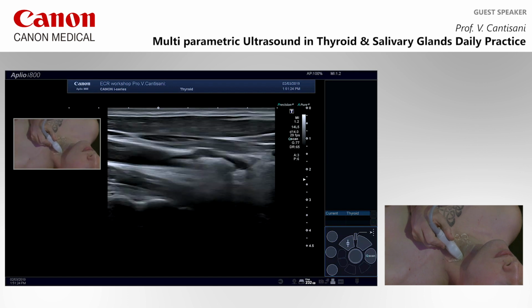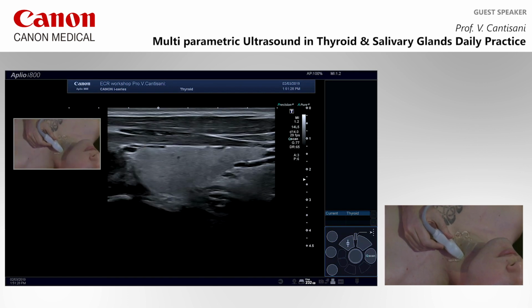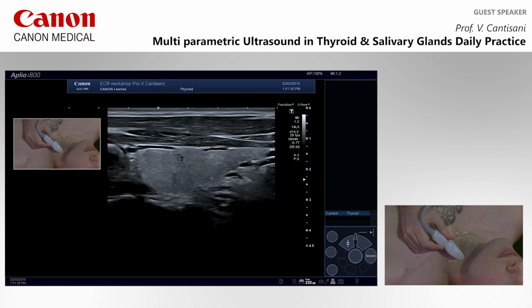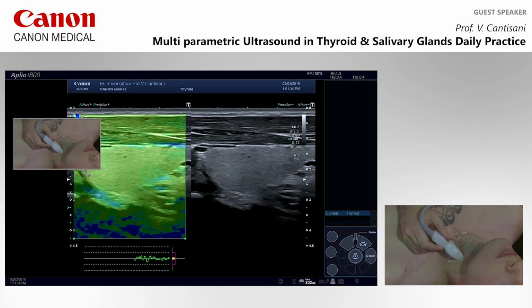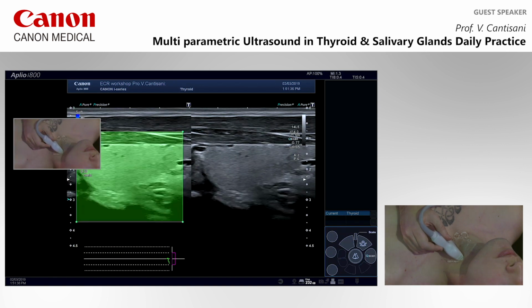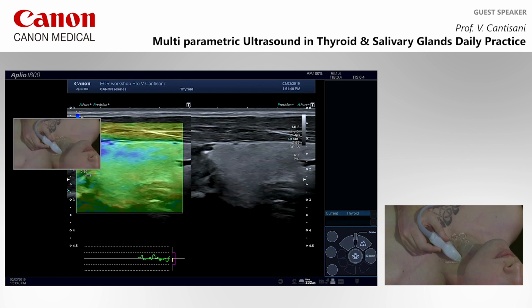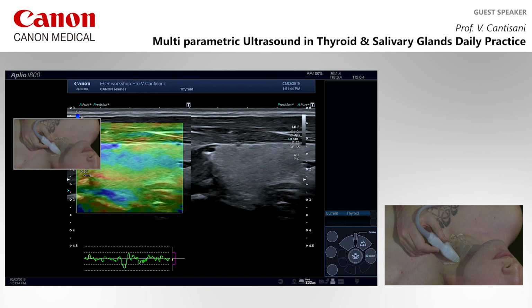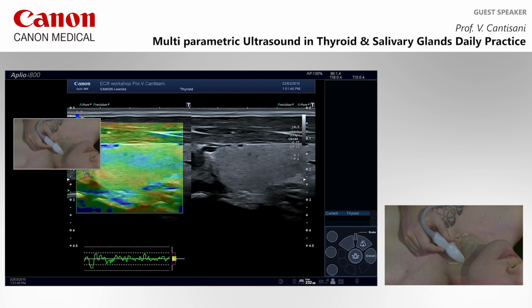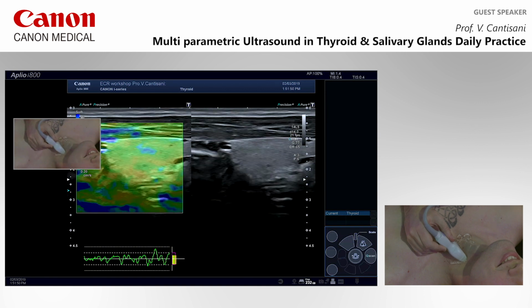Then I continue with my examination. So I'm trying to be very perpendicular. Then I start just pressing elasto. The box should be adjusted, I told you. Just be upward, below, then you start your examination. Look, there are already some artifacts. Carotid artery pulsation. He is very, very excited. So please, calm down, calm down.